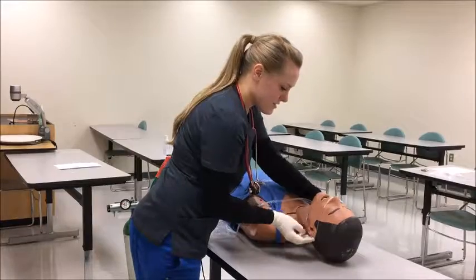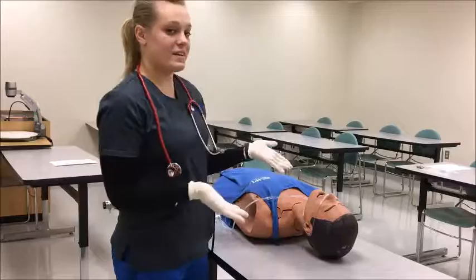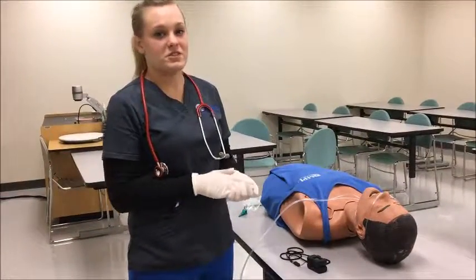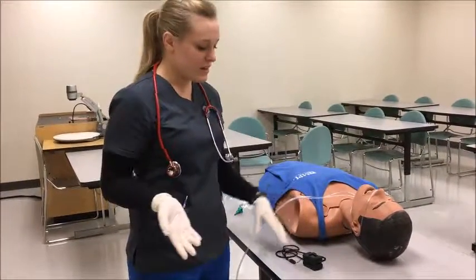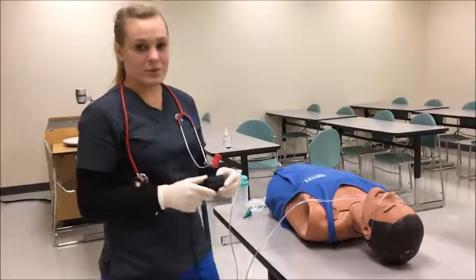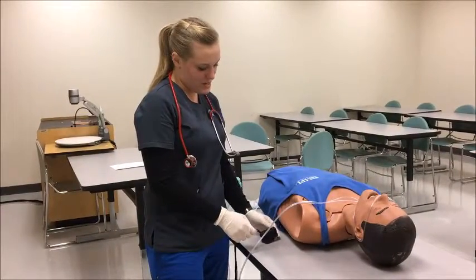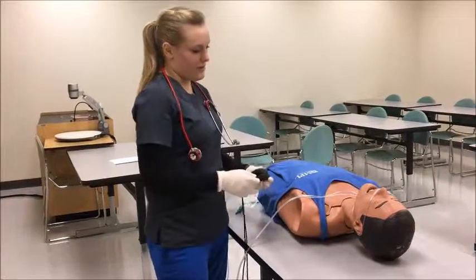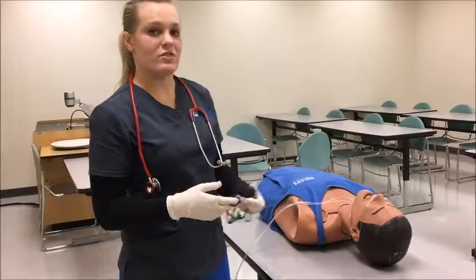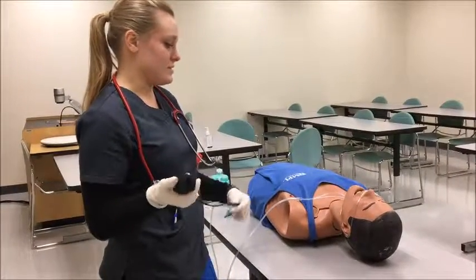Perfectly around his ears. And Mr. Smith, are you okay? Are you comfortable? Yes? Mr. Smith, are you comfortable? Everything working properly? Yes, the patient is comfortable. Everything is working perfectly. Now, just to assess and make sure that the procedure is working correctly, I'm going to put the pulse ox on his finger again. Measure it for a minute again. Okay, Mr. Smith, your oxygen is now at 92, which means the oxygen therapy is working and his oxygen is starting to rise.